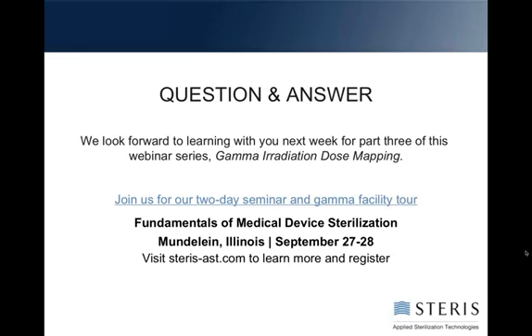Usually if it's one sample, it's not as much of a concern, but if it's multiple or it seems to be a trend, you may, for example, repeat a bioburden test with some more samples to get more data to see if it's consistent or if it was a one-off outlier. There may not be an exact answer for that. A lot of times it's going to be what you put in place to monitor your process.